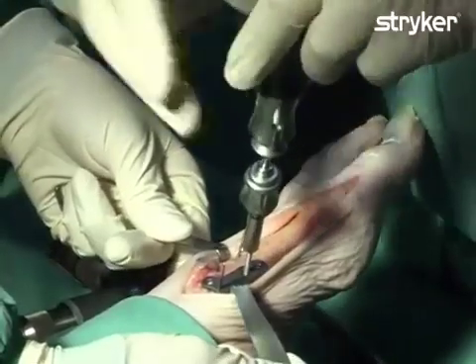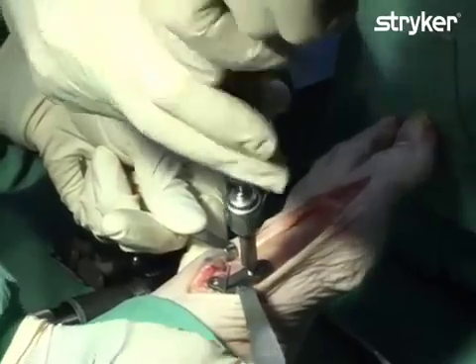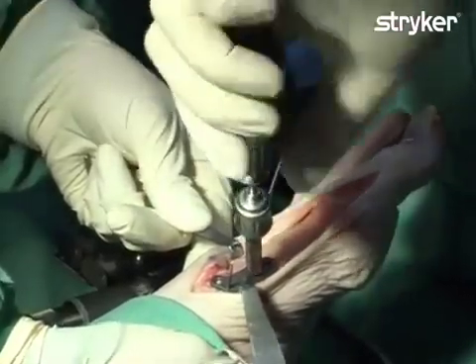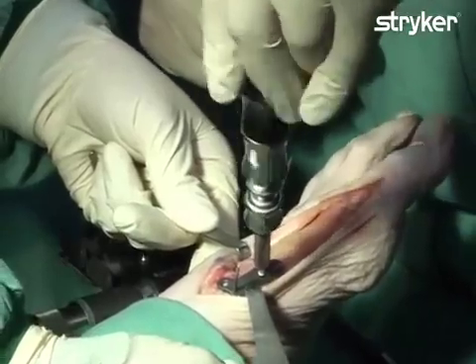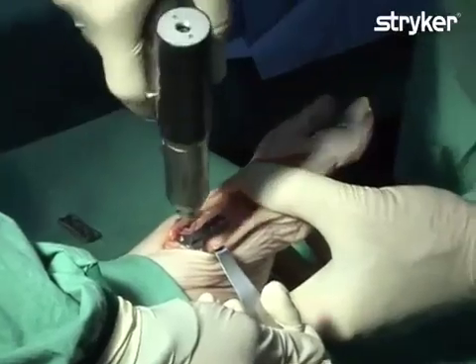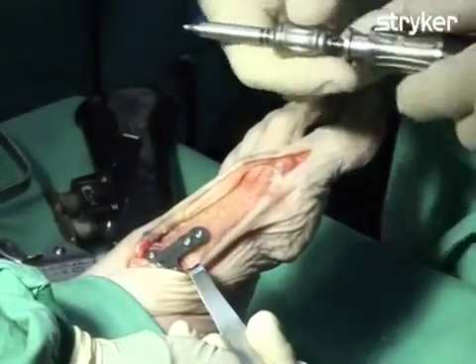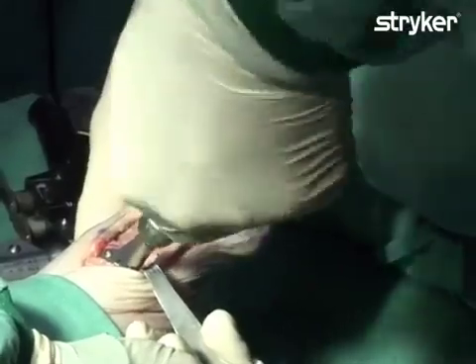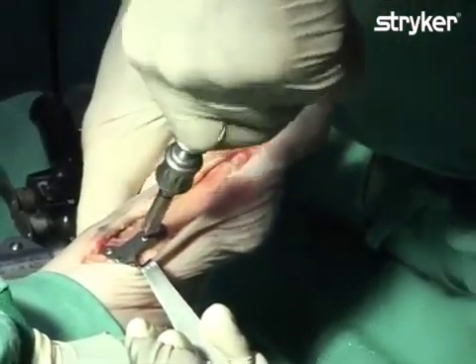The locking screw is inserted through the plate into the bone. As the screw head approaches the plate, the screw capture sleeve is disengaged and the screw is loosely tightened but not yet locked. The screw insertion process is then repeated for the remaining screws. Fixation is now complete and the K-wire used for provisional fixation of the plate can now be removed. Final tightening is performed for all remaining screws, using a two-finger tightening technique to avoid applying excessive torque.